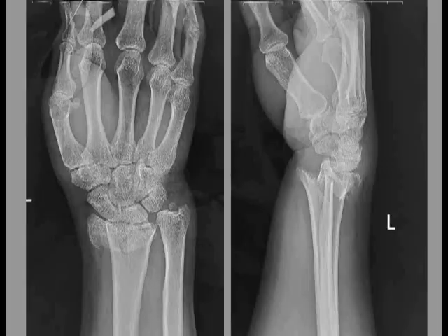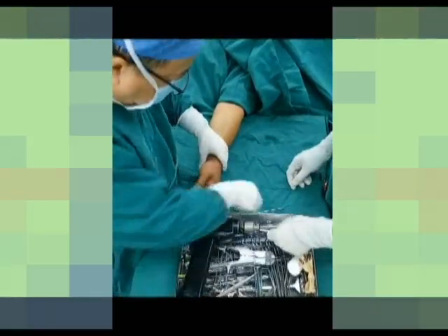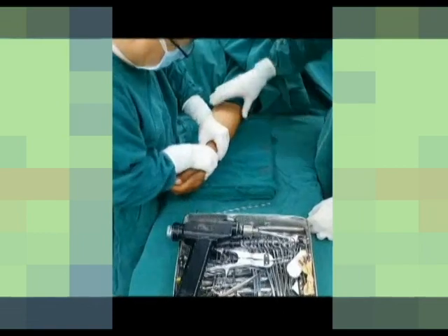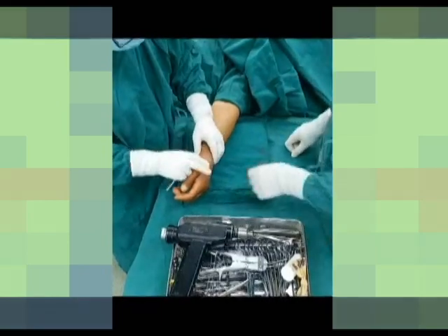This 45-year-old male patient is suffering a comminuted intra-articular distal radius fracture. The patient is placed supine with the injured upper limb abducted. The operation is performed without tourniquet control. We initially try to improve the deformity to facilitate the wire positioning.